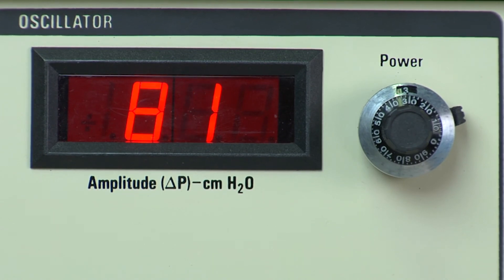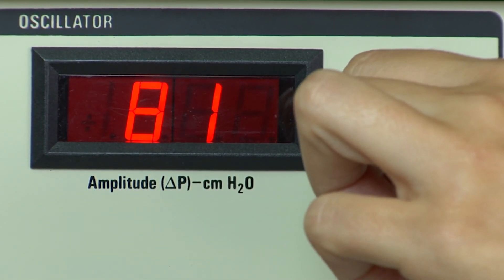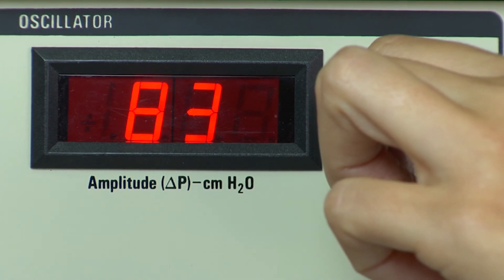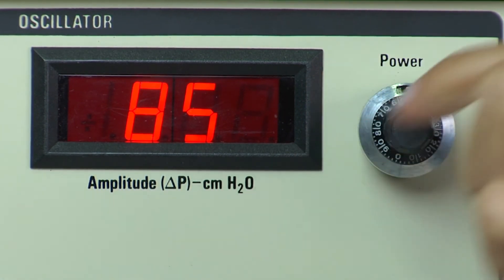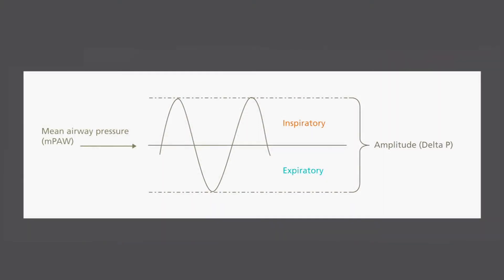Piston displacement is controlled by the power control, which is a graduated 10-turn potentiometer. The small lever on the control is a lock; it is set by moving the lever down. To unlock the control, lift the lever before turning. The displayed amplitude is the peak-to-peak oscillatory pressure measured at the airway opening. It's important to note that the pressure amplitude reported by the instrument is the sum of both the inspiratory and expiratory phases of the ventilator.